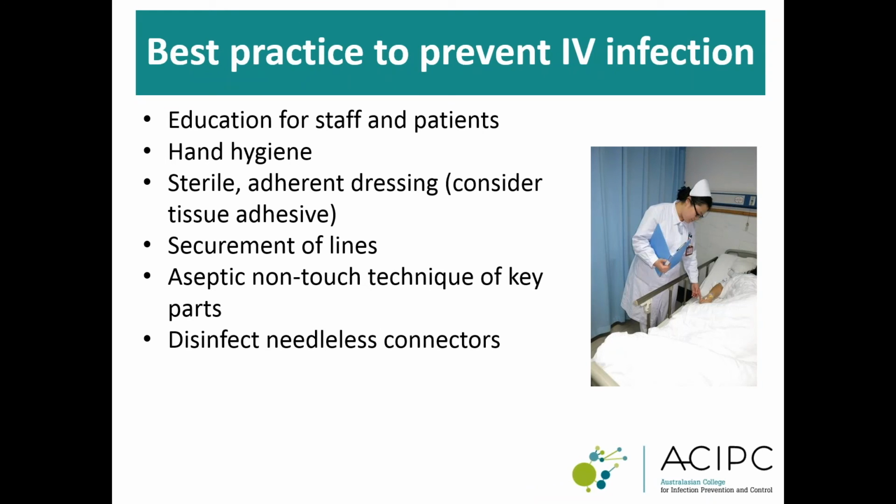Most complications associated with the use of IV catheters are preventable. Here are some simple strategies that have been shown to reduce or prevent infection. Education for staff and patients. This is a key element in reducing catheter-related infection.